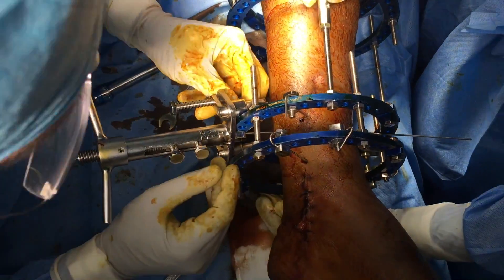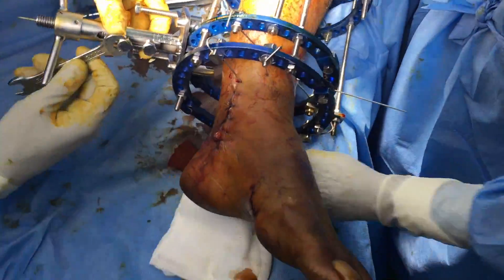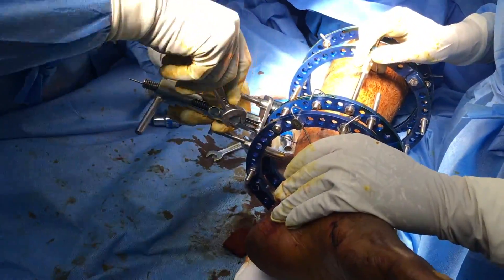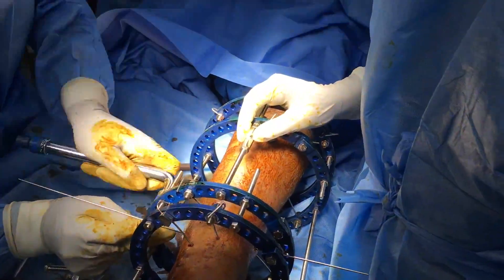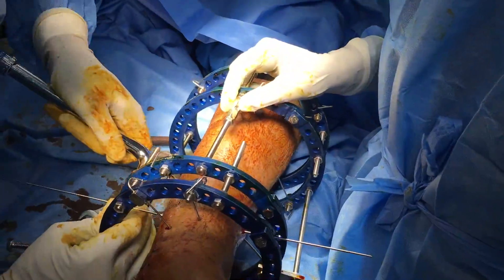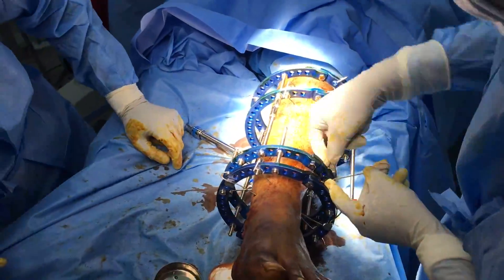It is checked under C-arm once again and once we are satisfied with the reduction, the remaining wires are passed, the wire is tightened, the tensioner is removed, and the opposite end of the olive wire is also tensioned.